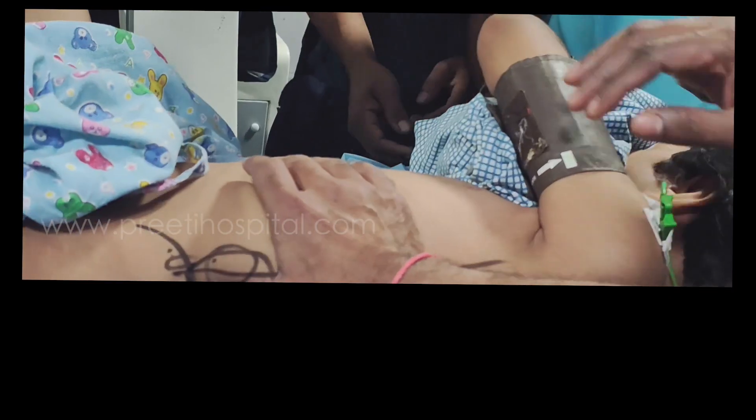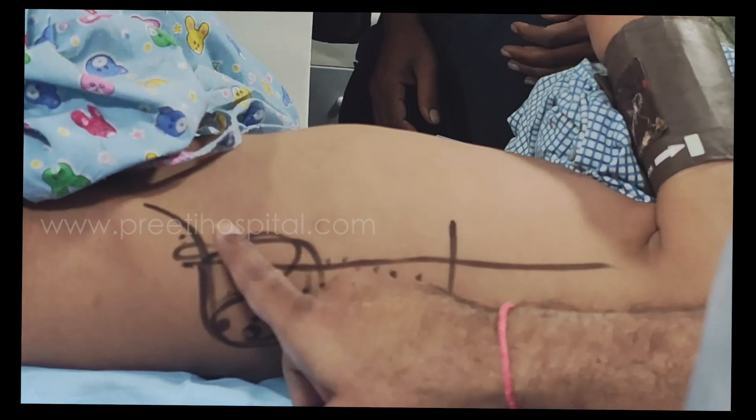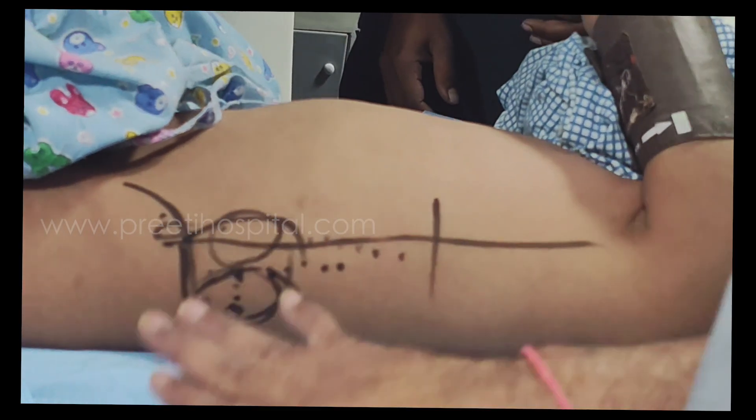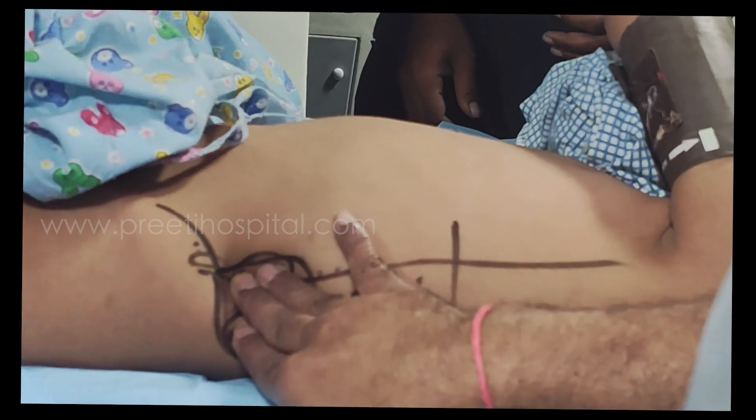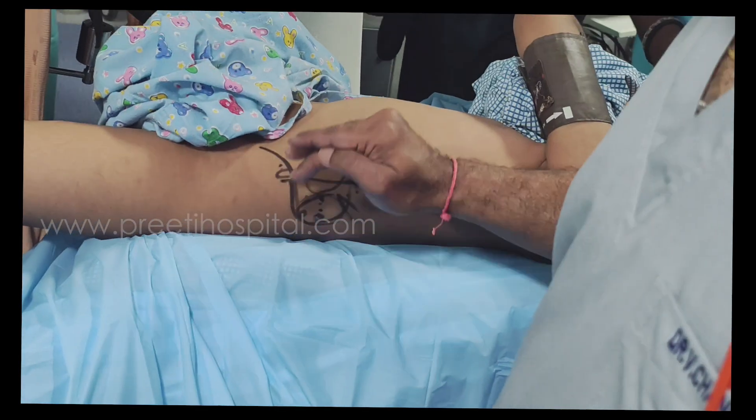This elasticity is much more in children, and the rectus sheath is the most powerful structure. So dilatation is very, very, very dangerous. Everything goes deep but the tissue will not give way. You have to keep pressure and dip steadily. Step-by-step dilatation is a must.